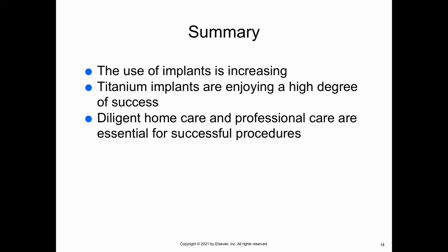In summary, dental implants are becoming more accepted by patients as a long-term replacement option. Having a success rate of approximately 95%, implants are an ideal means of treatment. It's not enough to just have an implant placed. They must be routinely maintained to ensure their success, and we as hygienists must know how to properly care for them. If you guys happen to have any questions or comments, please email me at hwells14@ivtech.edu.